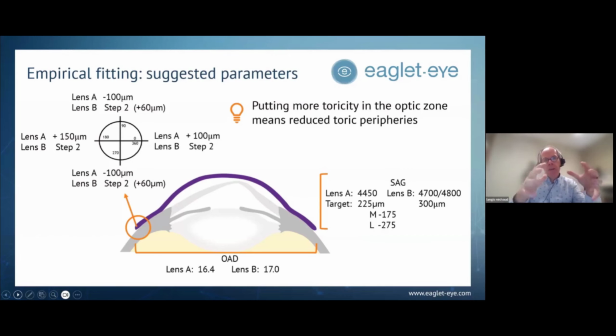to share the toricity between the conjunctiva and the vaulting chamber, which is really just on top of the limbal area. So separating these two entities and sharing the overall toricity helps us design lenses that are less complicated and more equilibrated, better centered, and obviously the vision will be better at the end because the lens is less decentered. We are better aligned in every quadrant, and the tear reservoir under the lens is more uniform also, which also contributes to the quality of vision provided by scleral lenses.